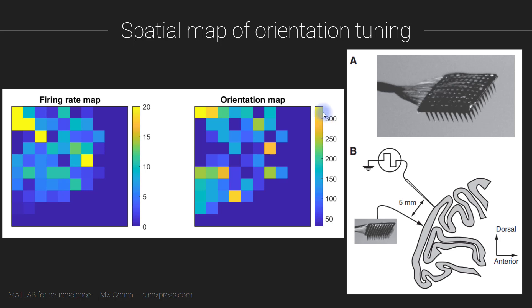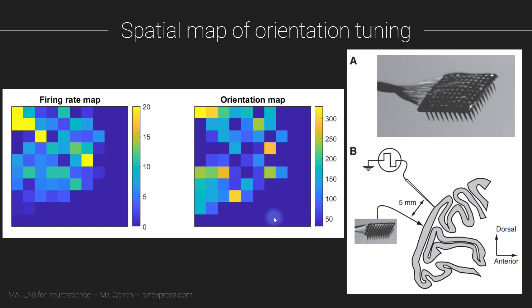The second problem is that we know from the previous video that not all of these physical electrodes have neurons, and not every neuron gave more than one action potential. So electrodes that have neurons that didn't fire at all or no neurons are actually colored here as if they are tuned to zero degrees, which isn't really appropriate.